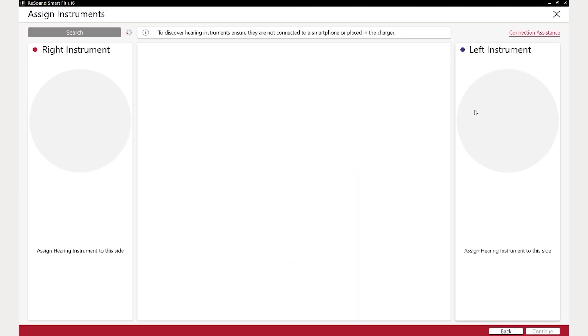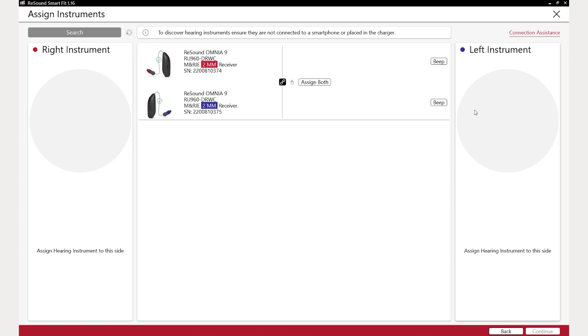The hearing aids will appear in the Assign Instruments screen. The hearing aids are automatically assigned left and right based on the attached receiver.